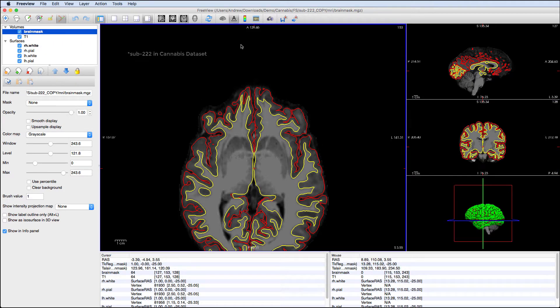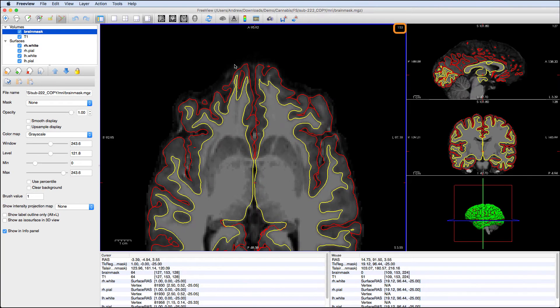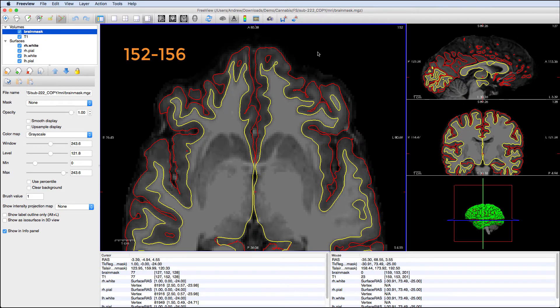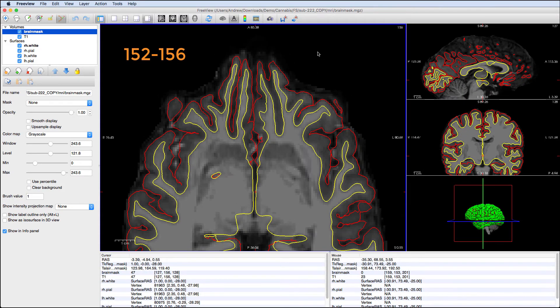As in the last video, note the slices where your error begins and where it ends. Here, I'm focusing on slices 152 to 156.